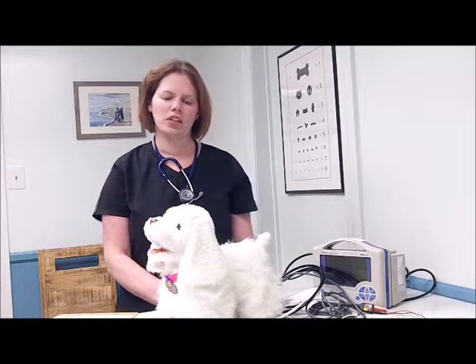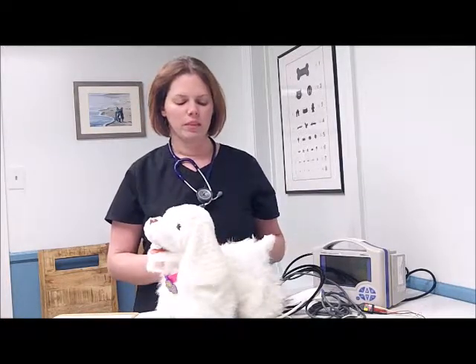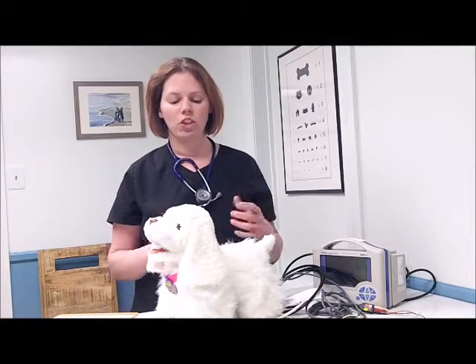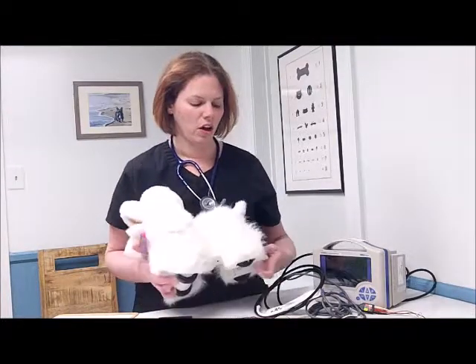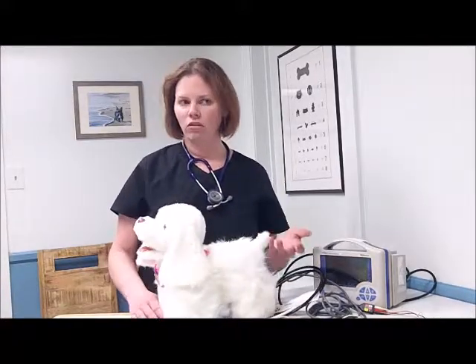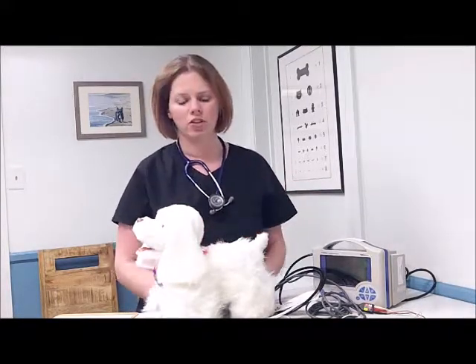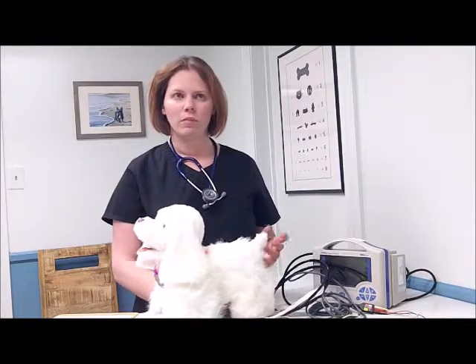Another parameter that you can be checking that kind of coincides with our blood pressure that we mentioned earlier is peripheral pulses. Sometimes the blood pressure machines are not available, so you can check a blood pressure by ideally using other types of machinery, but you can check pedal pulses. Usually they're on the plantar and palmar surfaces of the paws, and generally it can be hypothesized that if you can feel a pedal pulse with your fingers, then your blood pressure is above 60. So that is another way to measure that.